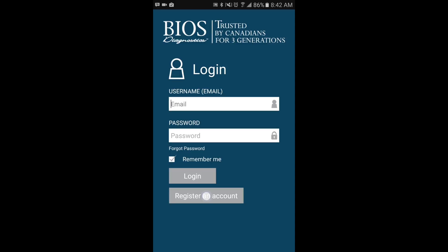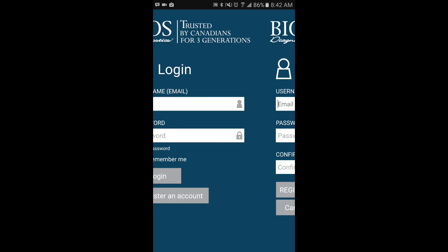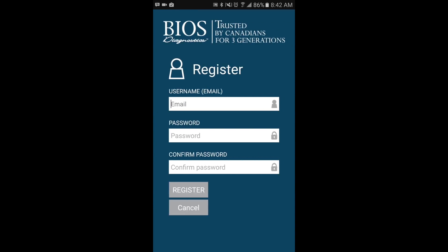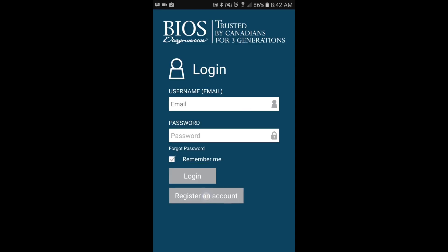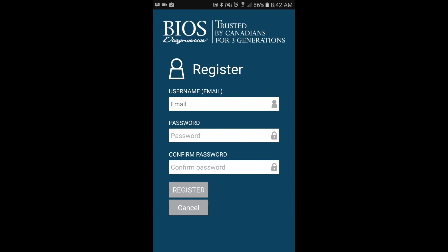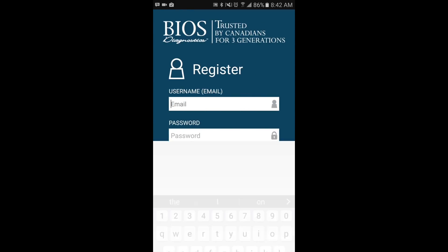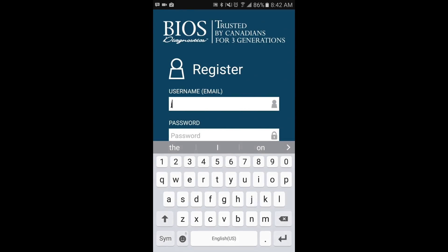If you don't already have an account, one will need to be created. First select the Register button from the opening screen.